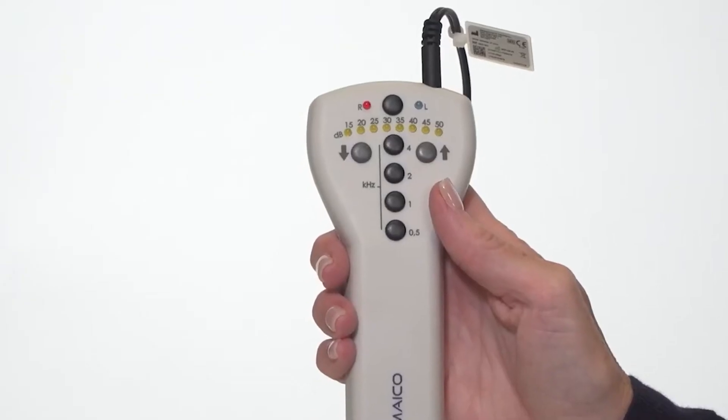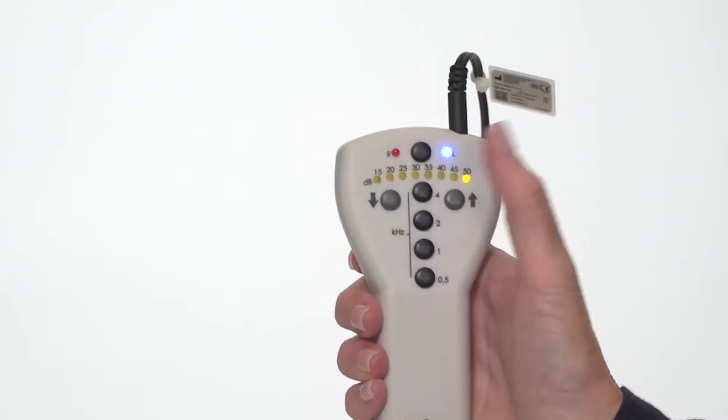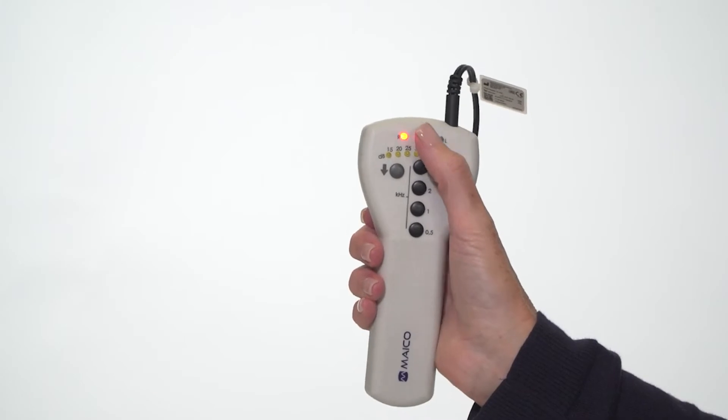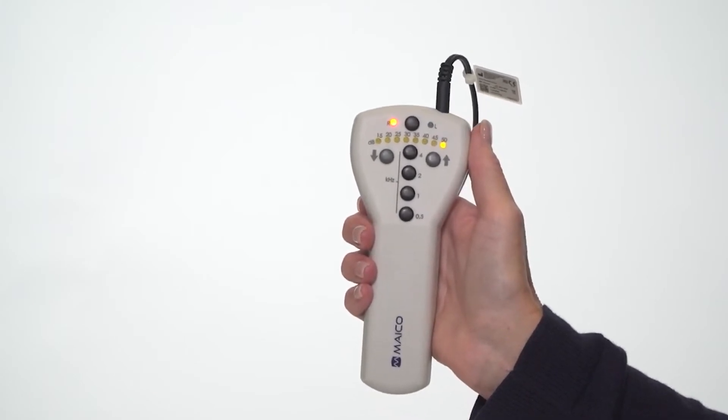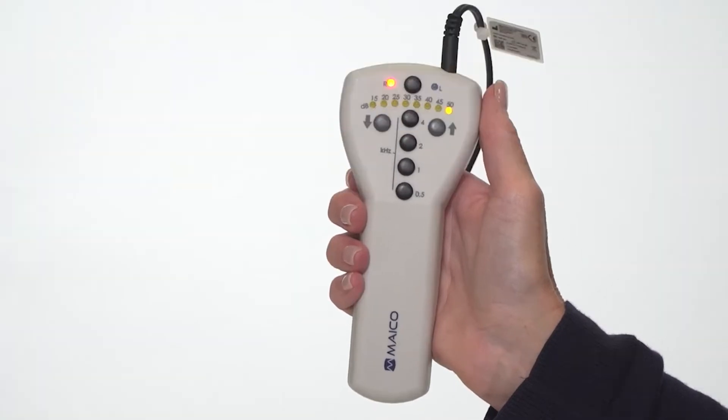Power on the device by pressing the black button at the top of the device. Press the same button for ear selection. The red LED is for the right ear and the blue LED is for the left ear.